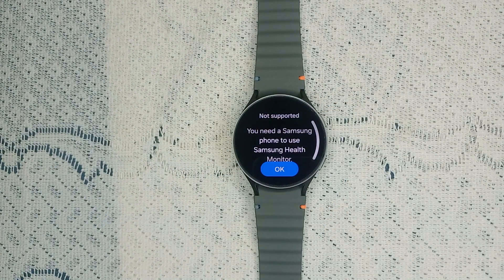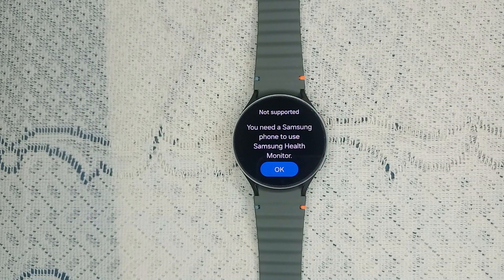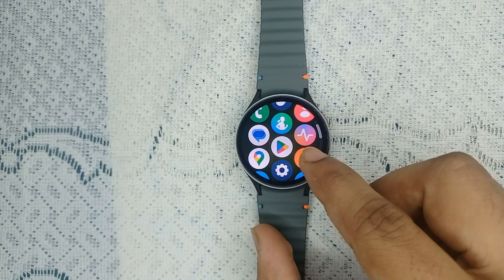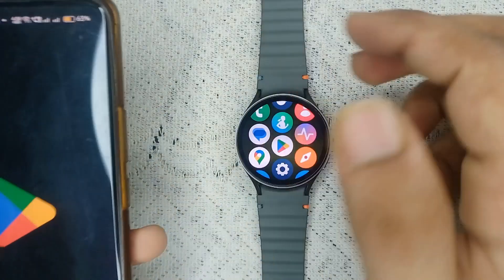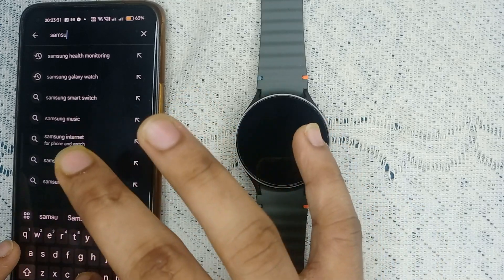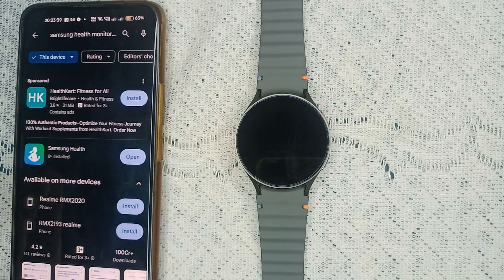First thing first, you have to ensure that you have a Samsung mobile with the latest software update. When you turn on blood pressure on your watch, it will ask you that you need a Samsung phone to use Samsung Health Monitor. So if you have a Samsung phone with a newer version, you can simply install the Samsung Health app. Open the Play Store, search for Samsung Health, and here you will find the app called Samsung Health. Firstly, you have to ensure to download it.